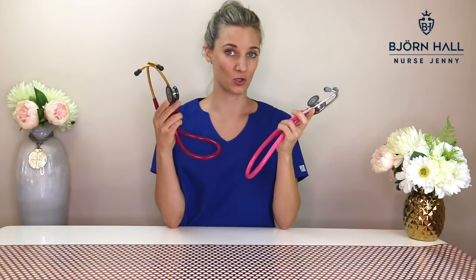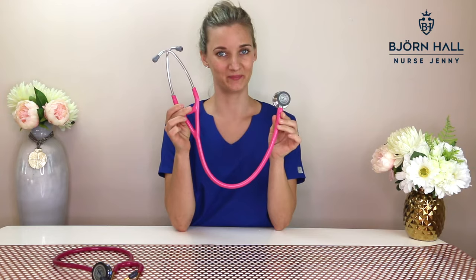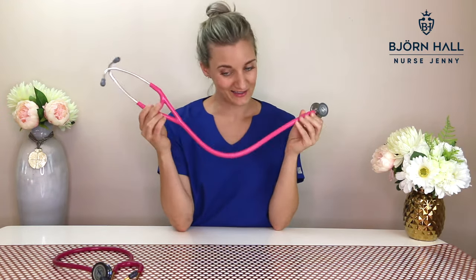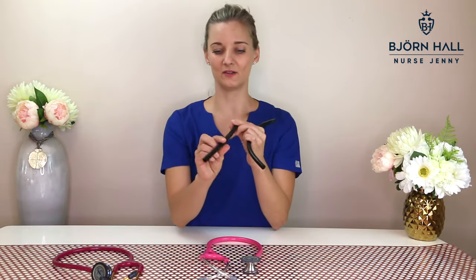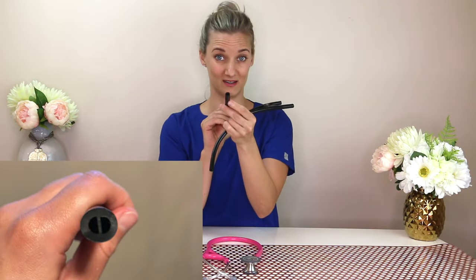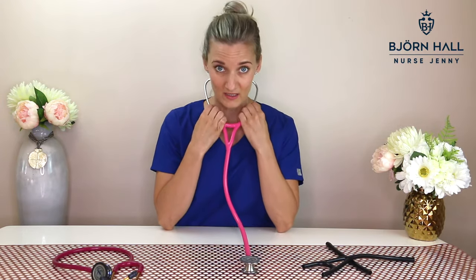So I'll start with what makes these two stethoscopes different. Looking at the Cardiology 4, it's a cardiology stethoscope which means it's got dual lumen tubing. When I first started my research I actually bought a Cardiology 4 and cut it apart. If you can see it, this is how dual lumen tubing looks inside — it's got two channels going through the tubing, one channel goes to your right ear and the other channel goes to your left.